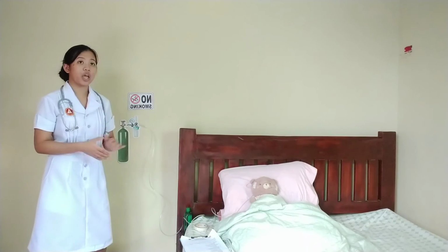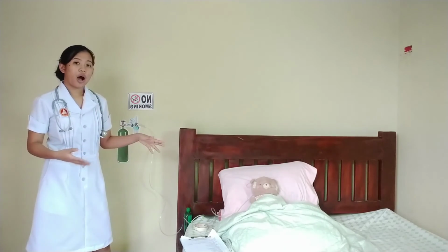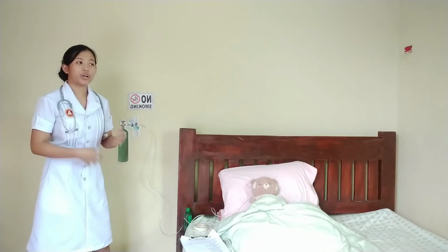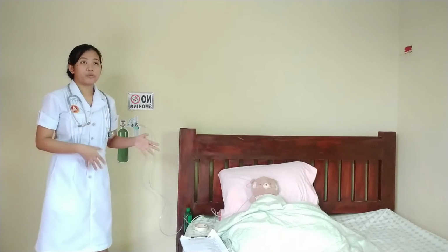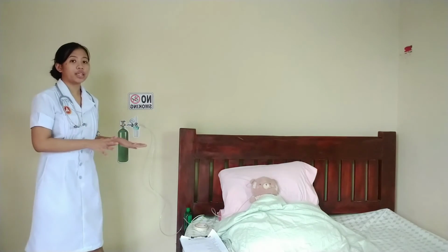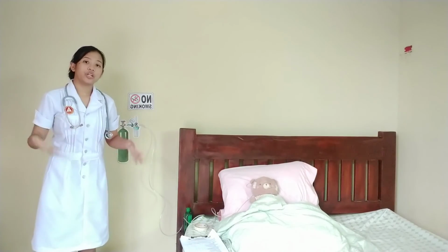So we will check for the liter flow and the water level of the humidifier, to be sure that the water is not collecting in the dependent loops of the tubing, and we should check the equipment on a regular basis, every 30 minutes or when providing nursing care.